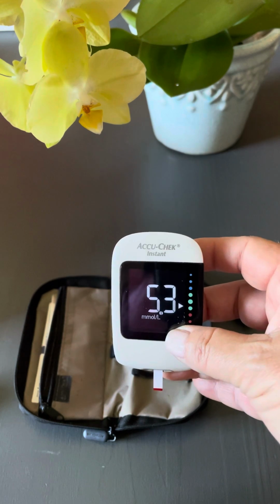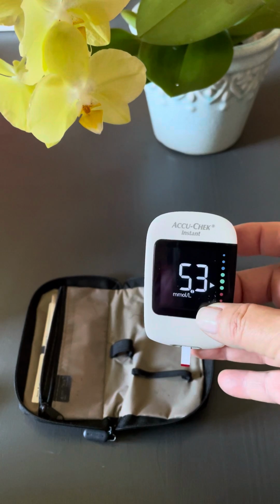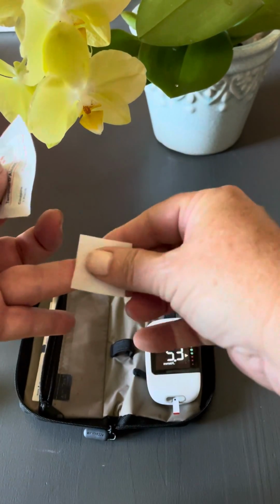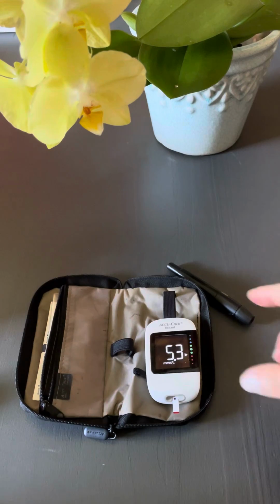So this indicates a 5.3 reading, which is not too bad since I've had some coffee, and that usually raises my blood sugar by a little bit. I then just use the swab to clean that off.